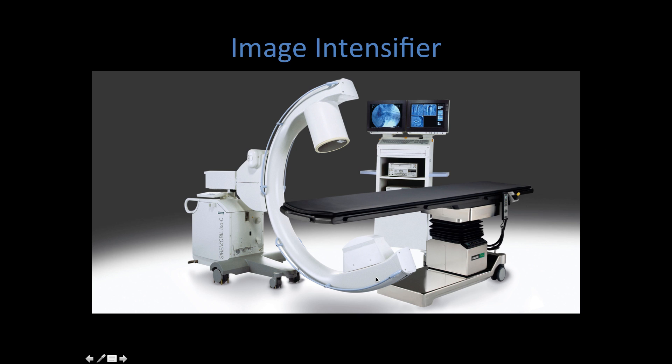And now we're going to focus on the actual image intensifier tube. For the purpose of this video, you should already be acquainted with the process of x-ray beam generation, so we start with that as a given. We have the x-ray beam that's generated and we're emitting it towards our patient, in this case our patient is Dr. Bouchong.